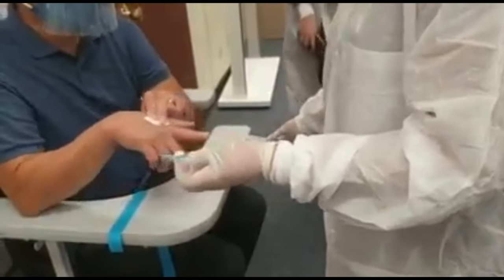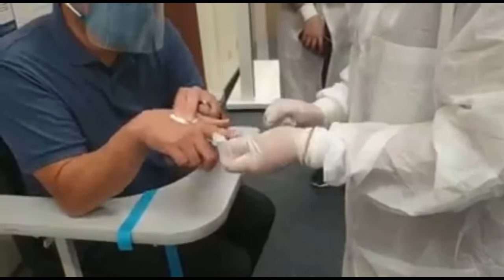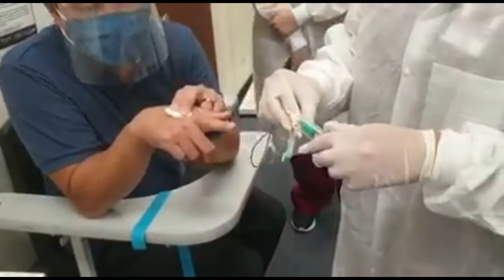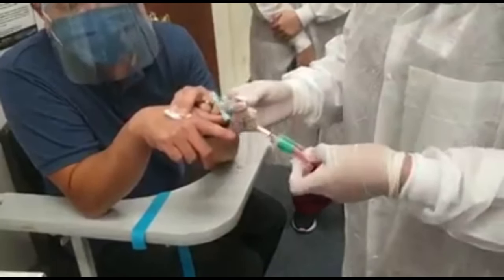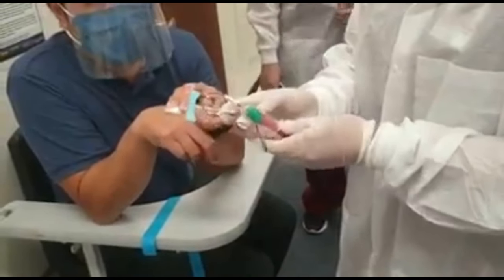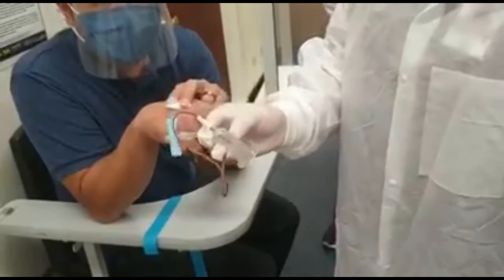And then what you can do also, before you do this, you still have blood in the line. What you can do is get your tube again and get the remaining blood in the line. See if there's enough vacuum. If not, it's fine. Yeah, there's no more vacuum. So go ahead and remove the tube. What do you do with it?